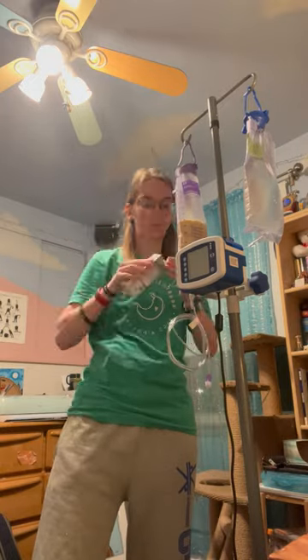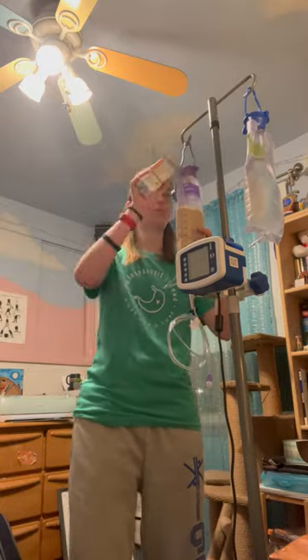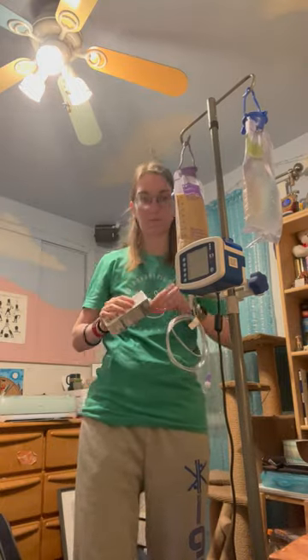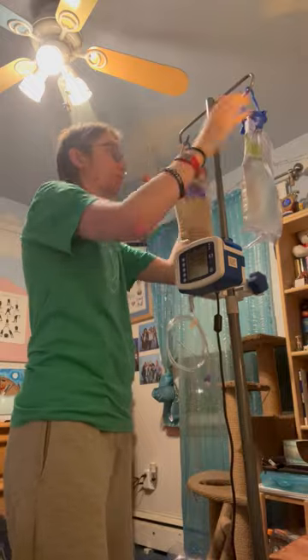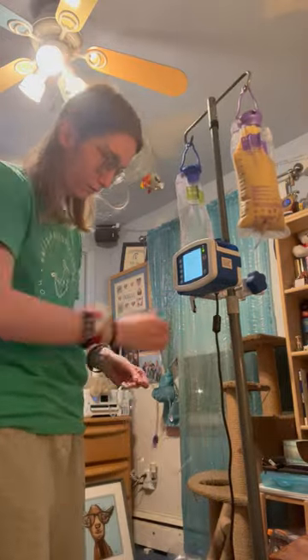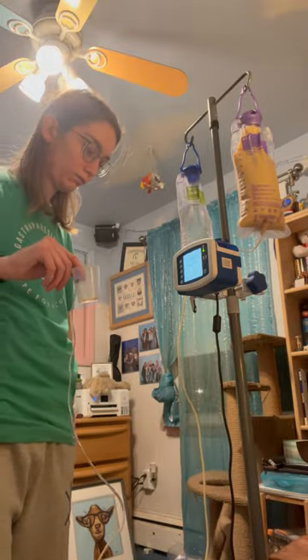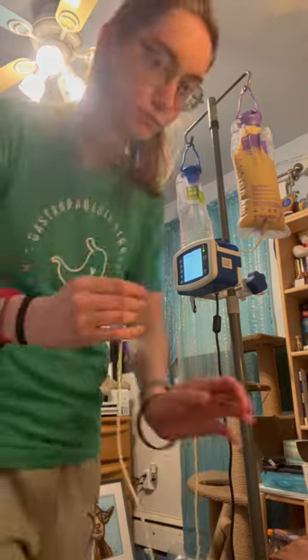After that, it's time to open up all my formula bottles and pour them into the feed bag. I have four bottles that I do over the course of 12 to 12 and a half hours, and then I prime my pump so that it gets all the air out, and then I'm able to connect it and I'm ready to go for the night.